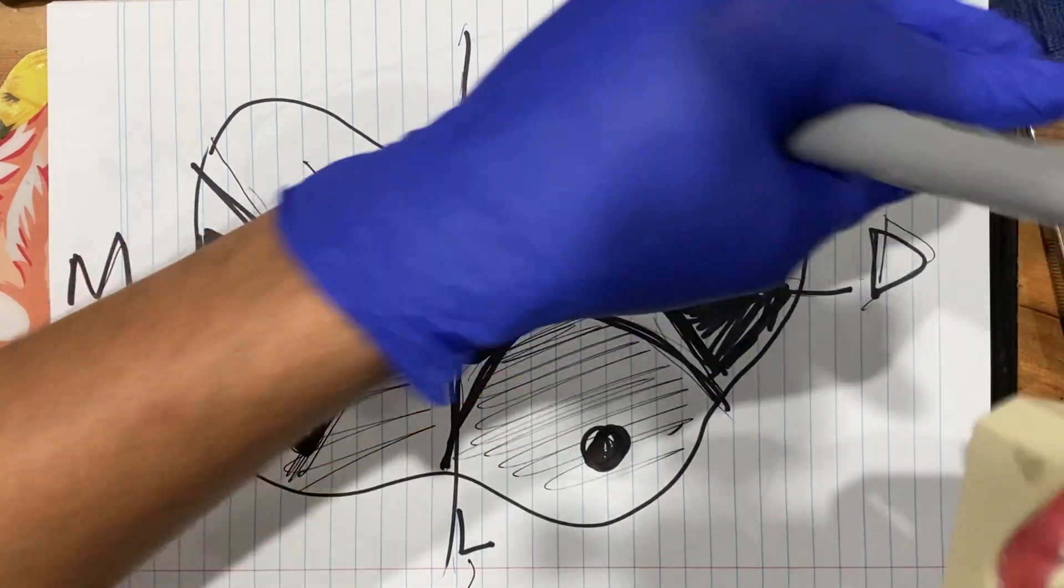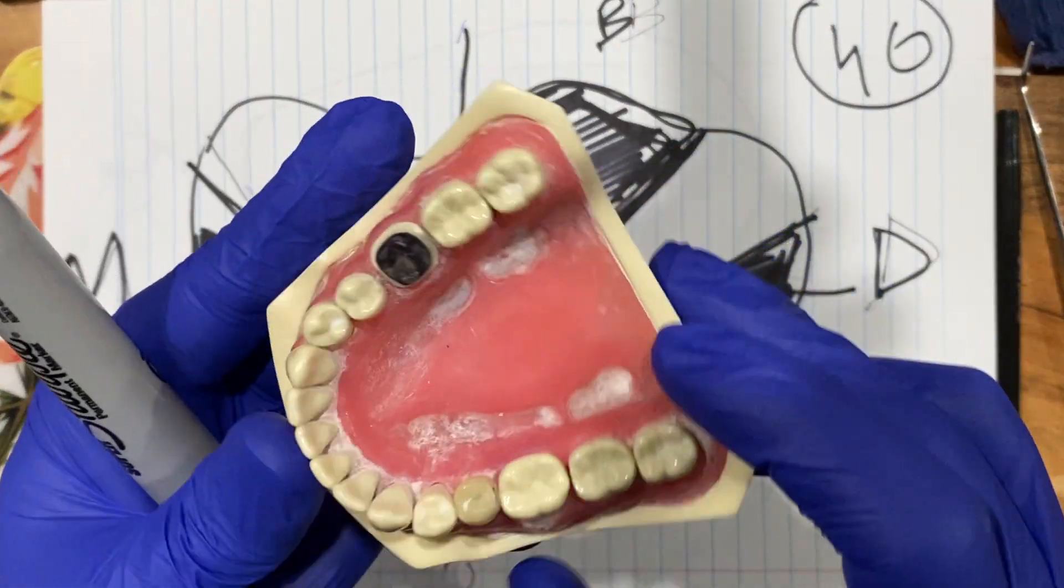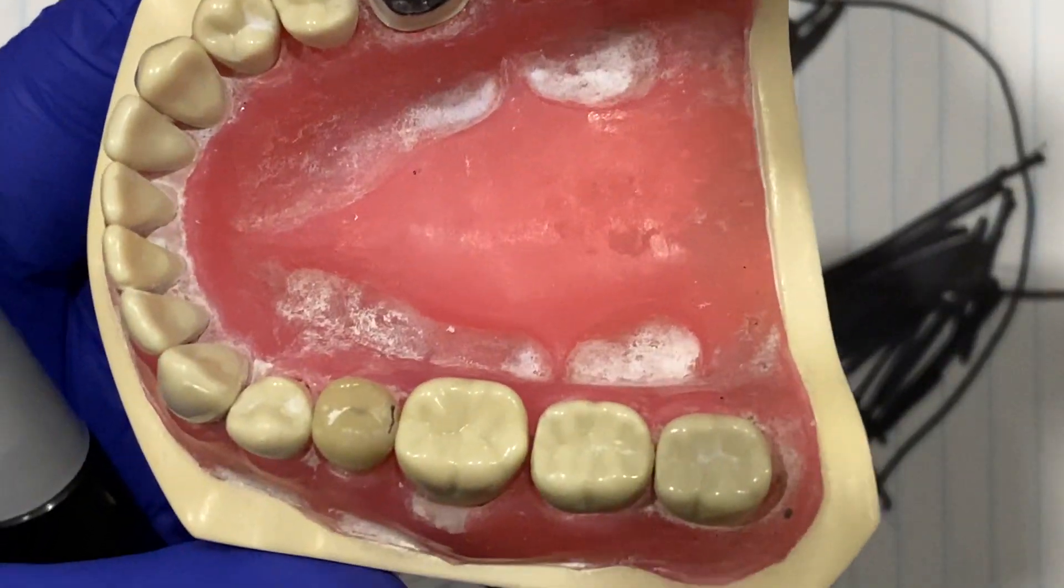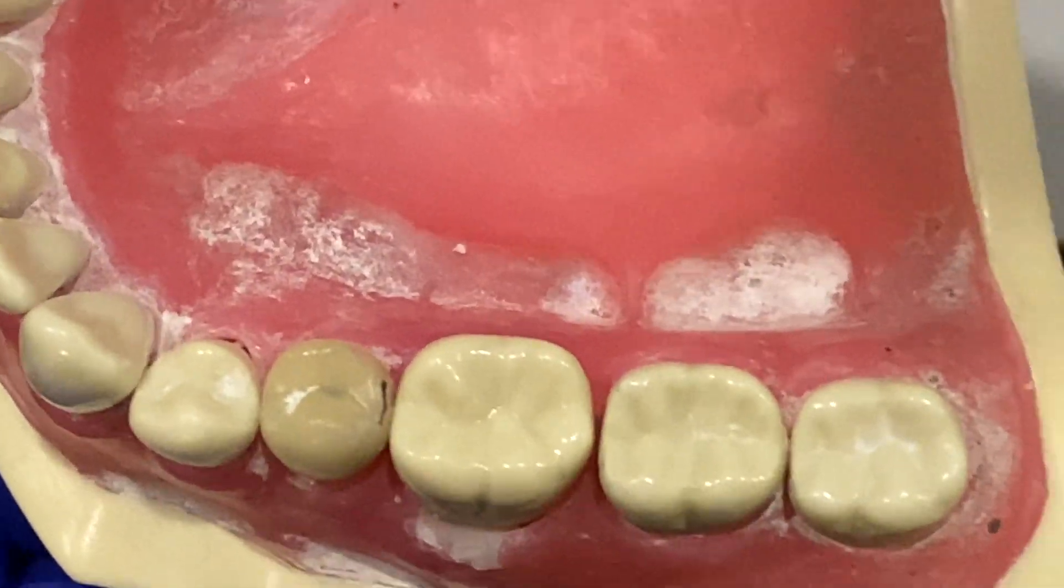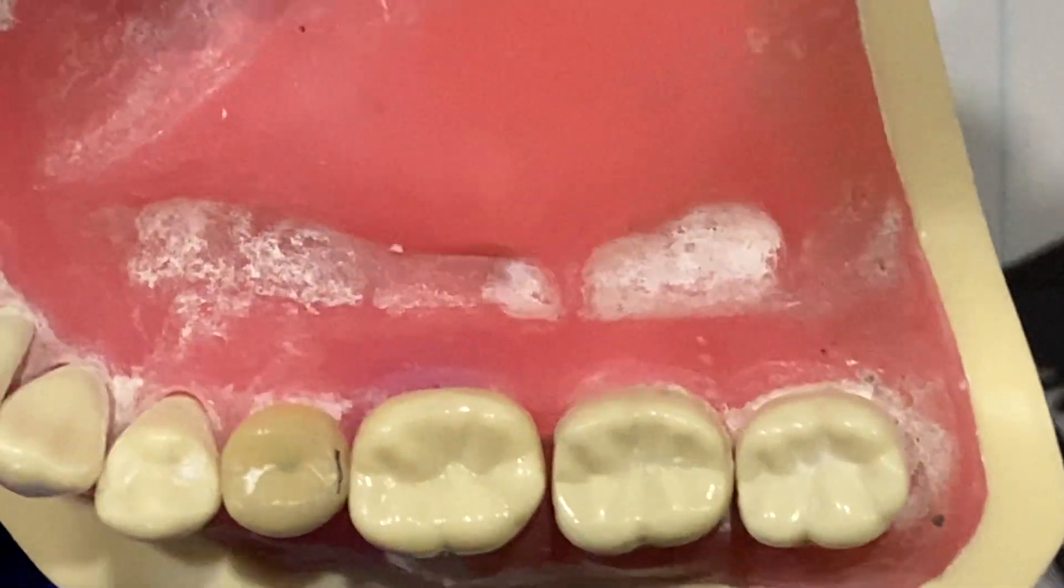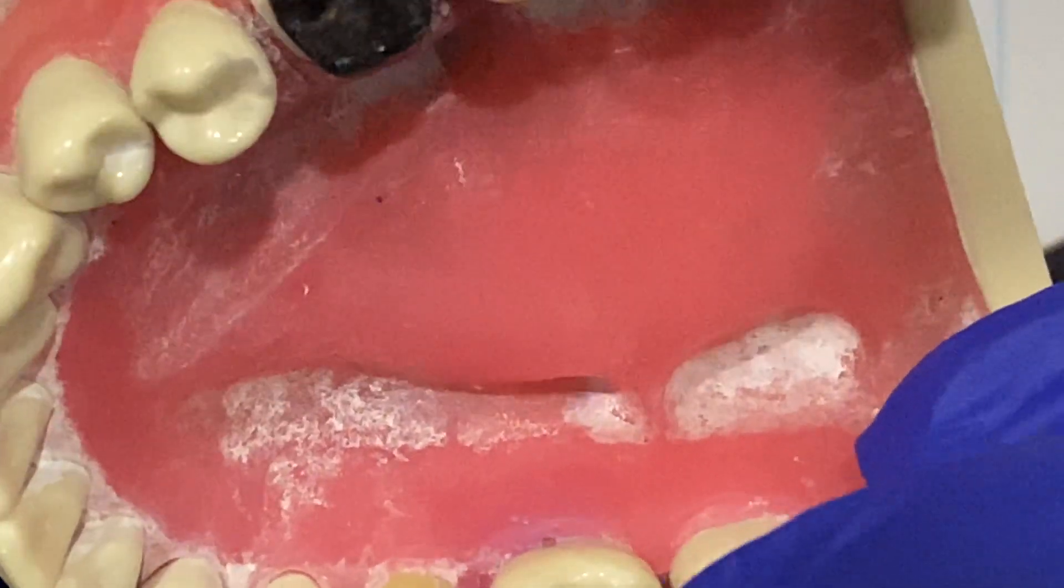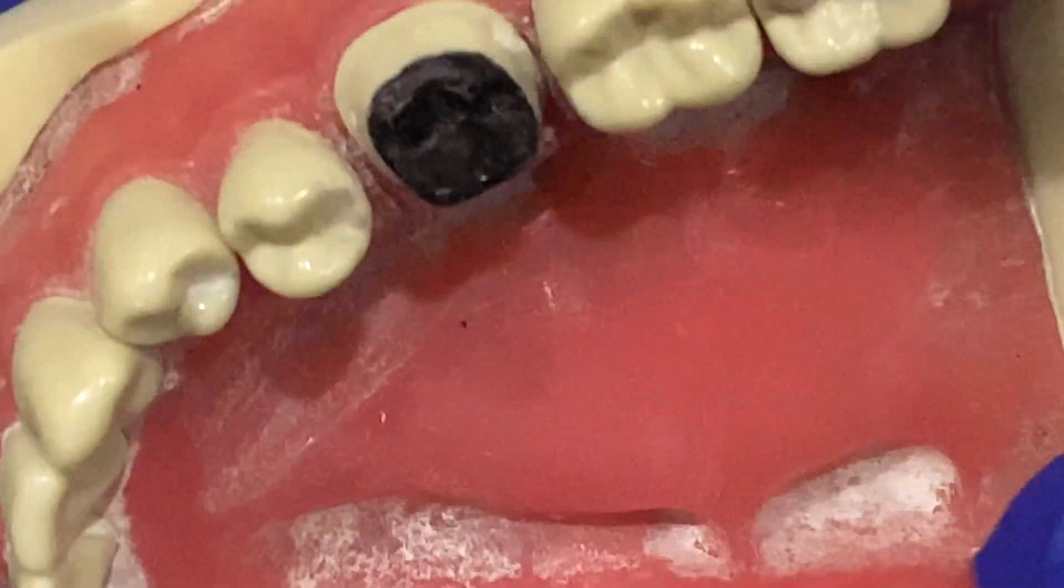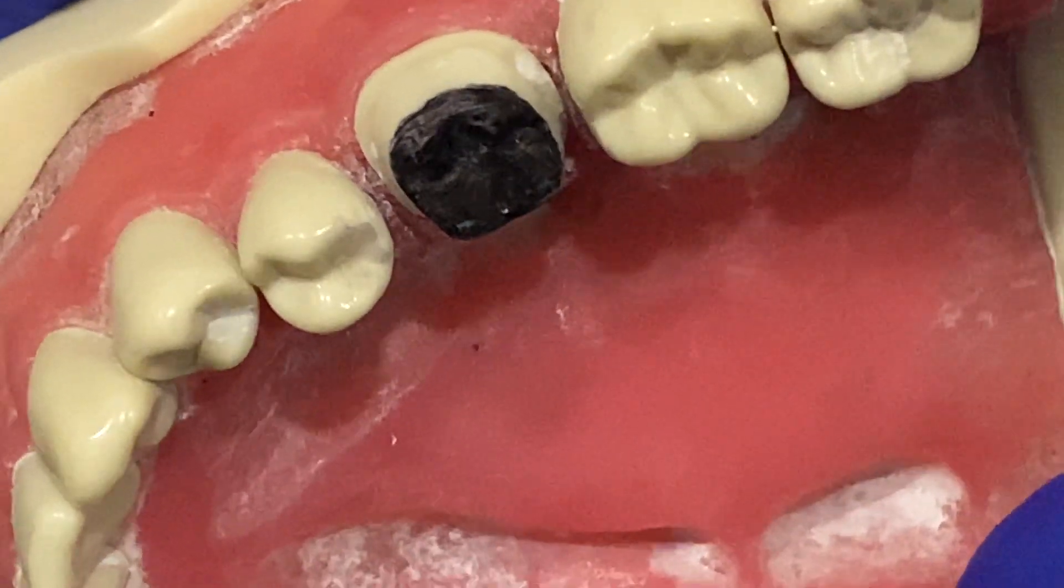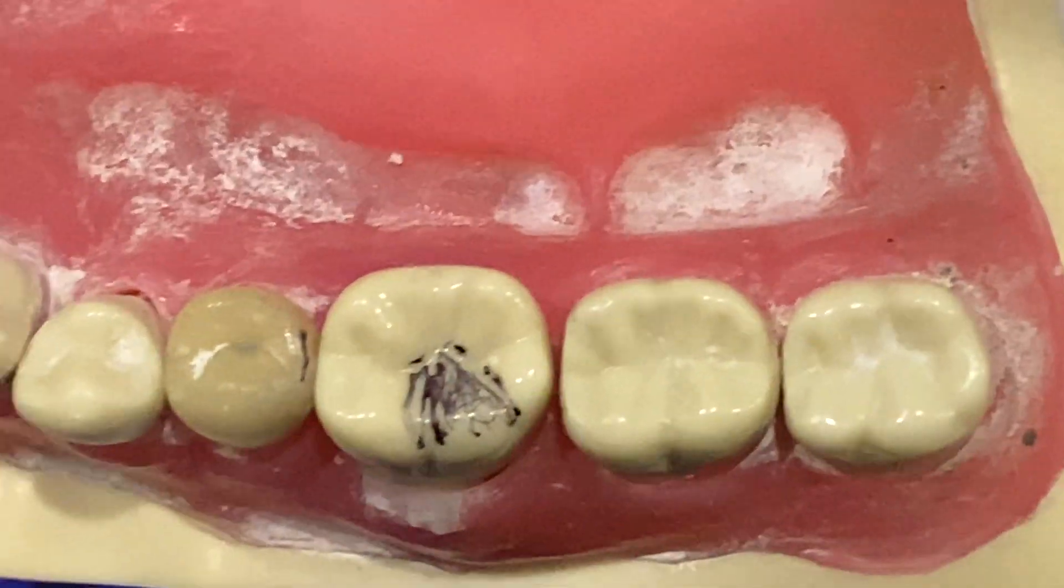Now if I look a bit closer, see if I can zoom in. This is a 3.6, not a 4.6, but just to give you a bit of an idea. Look at where the distobuccal is going. Look at the distobuccal.